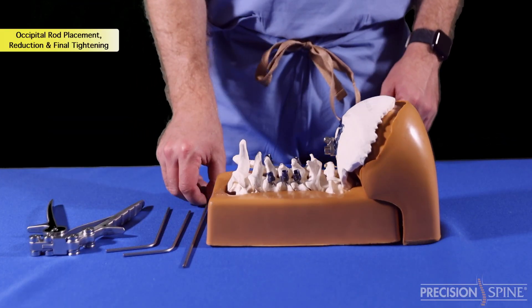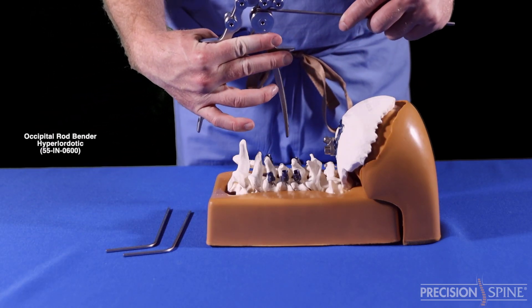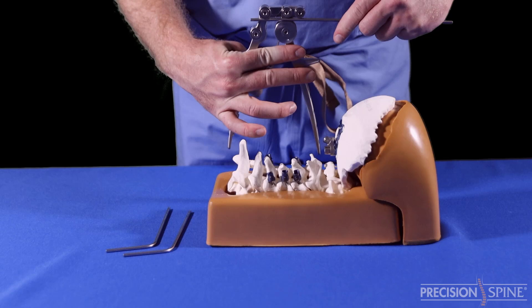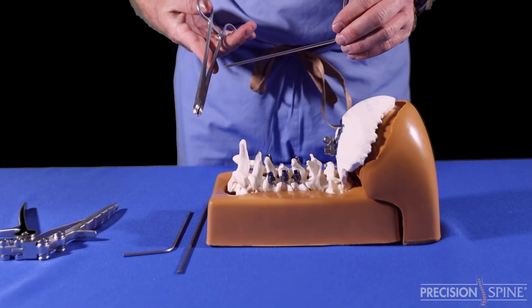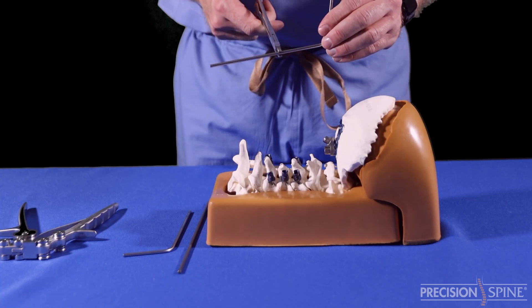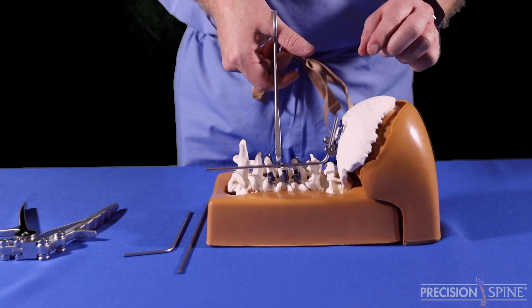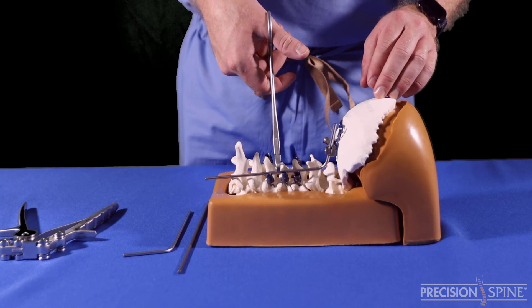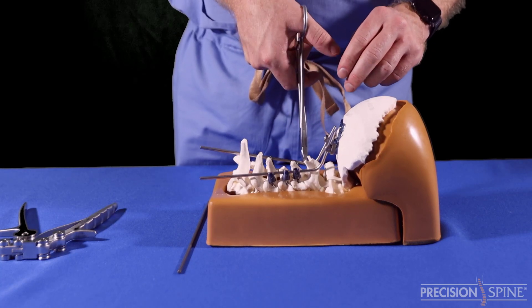Step 4: Occipital Rod Placement, Reduction and Final Tightening. Use the occipital rod bender to shape the rod. There are also pre-contoured rods that can be further adjusted by the occipital plate bender. Next, place the rod in the tulips of the screws and occipital plate using the rod inserter instrument. All rod reduction instruments from the POCT set are compatible with the occipital plate.